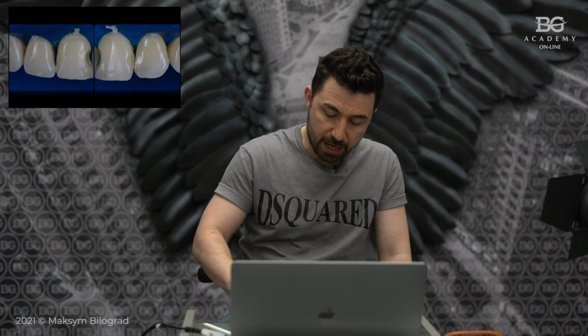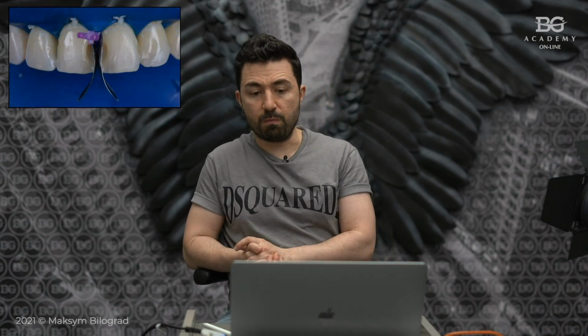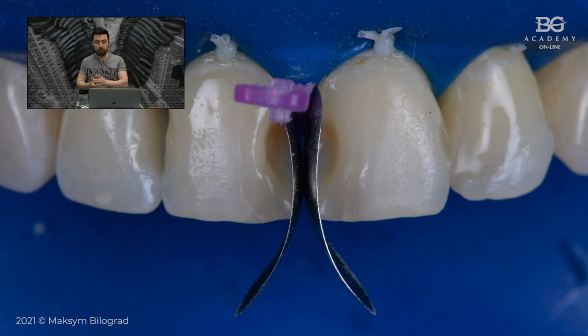Okay, now next is interproximal contact points. From my point of view, one of the best options to restore proximal areas is to utilize these sectional matrices that actually were designed for molar and premolar teeth, but we use them in vertical position with a wedge, 15 microns. We use them too, but not because we are going to restore two contacts at the same time. It's not a good idea to restore two contacts at the same time because you may end up with not tight interproximal contact. So now we are going to restore one and then we will be doing another one.